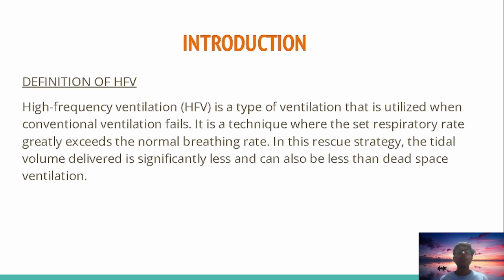Before going to the topic of HFOV, first we want to know what HFV is, that is high frequency ventilation. High frequency ventilation is a type of ventilation that is utilized when conventional ventilation fails. It is a technique where the set respiratory rate greatly exceeds the normal breathing rate. In this rescue strategy, the tidal volume delivery is significantly less and can also be less than dead space ventilation.